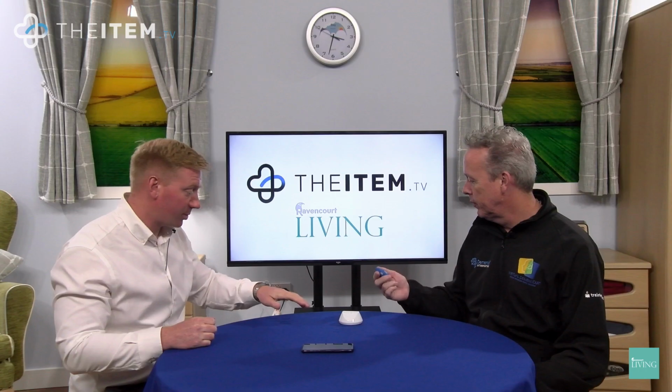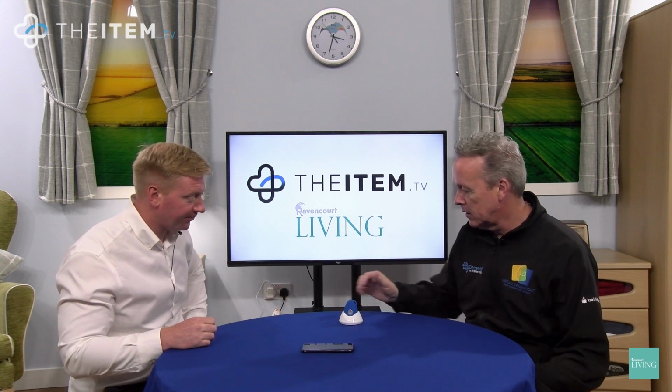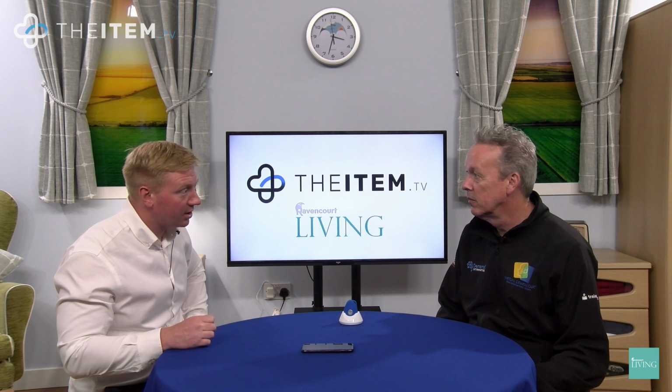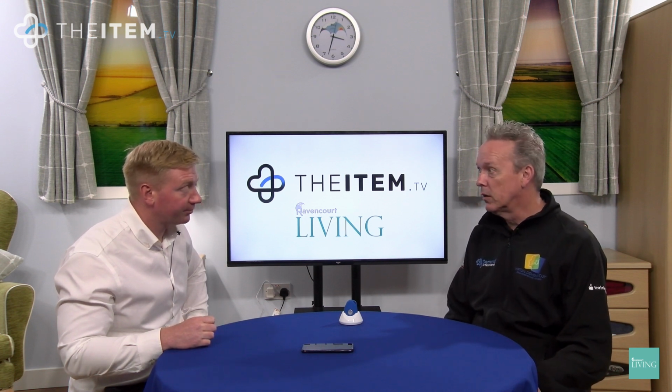Yeah, so that just needs plugging into the mains, and then when it drops in, it'll automatically start charging. That's fantastic. And how long does it take to charge roughly? 4 to 5 hours, and that will give you about 48 hours worth of charge. Okay, a good length of time then.